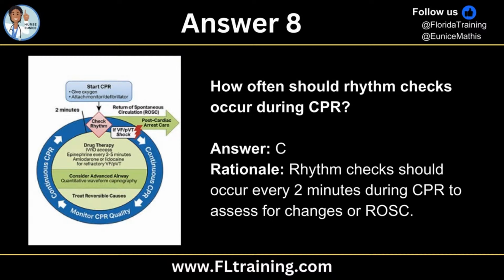So whenever the compressor switches, they have 10 seconds to switch. That's when no hands are on the chest, and your team members can actually look at the EKG, the heart monitor, telemetry monitor, without any interruptions or any interference from those chest compressions. So they have 10 seconds to look at that rhythm.